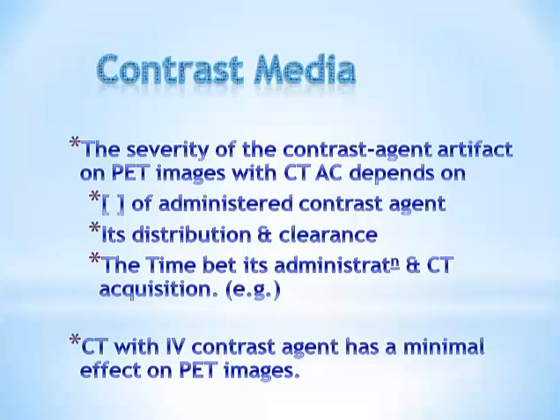CT with the intravenous contrast agent has a minimal effect on PET images. Yes, it's because of the characteristics that I've just mentioned. For the intravenous contrast agent, it has a fast clearance and dilution. So at the time of our imaging, the concentration will be very minimal.